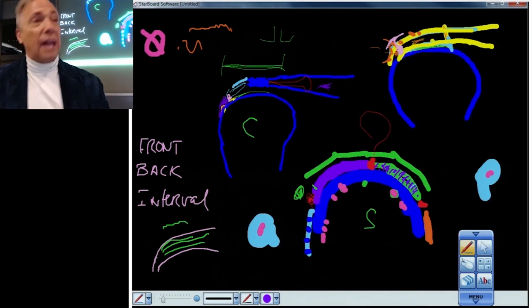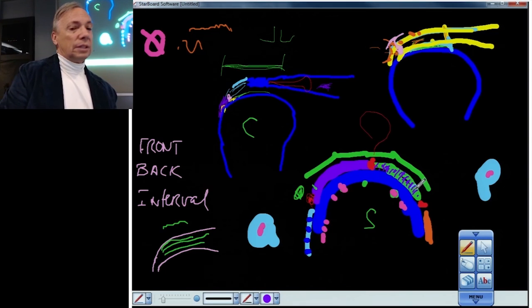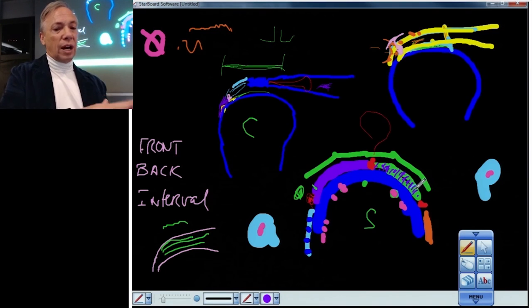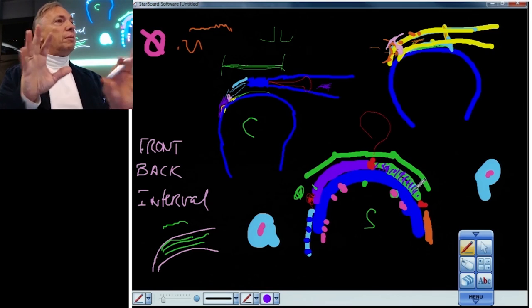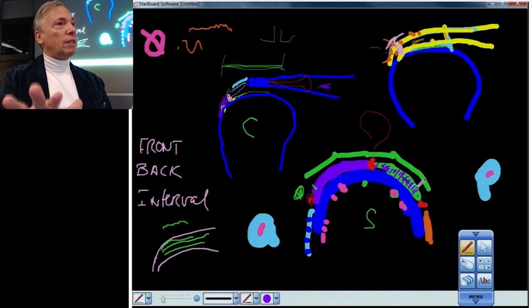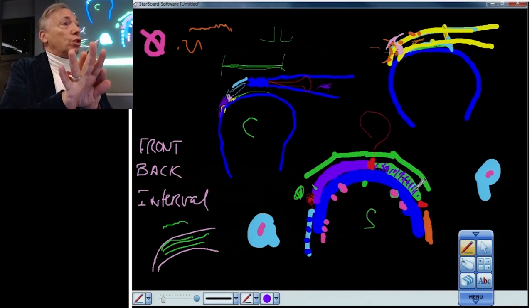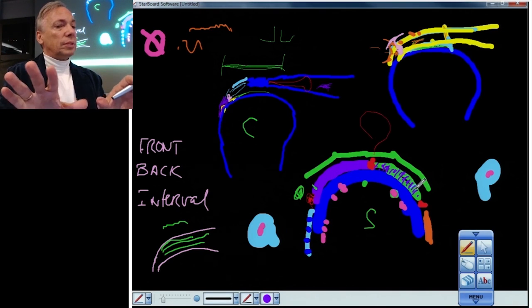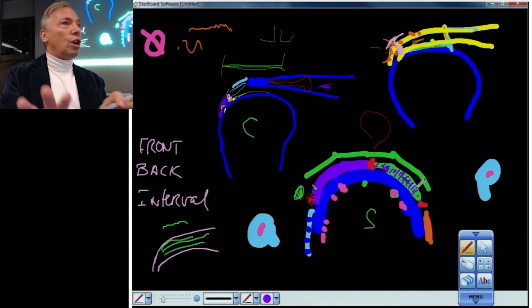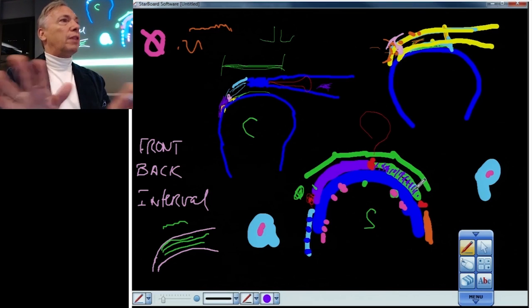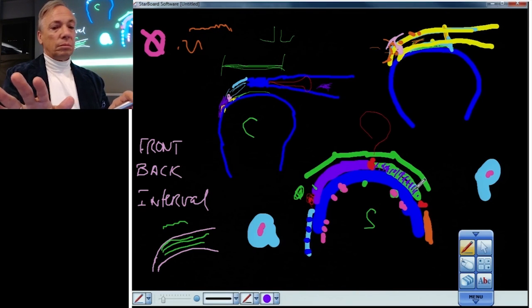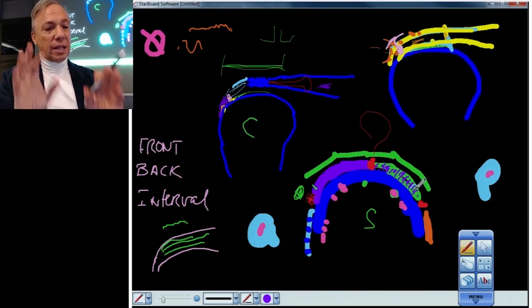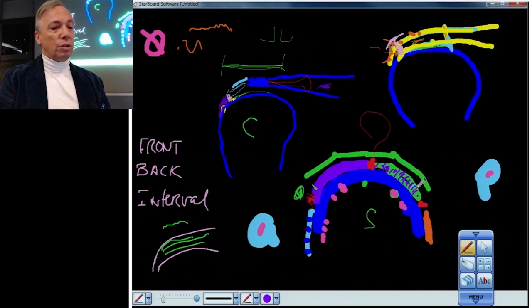It looks a lot like Bart Simpson's hair. They're much flatter in the supraspinatus, it looks more confluent. So if you have inflammation or swelling of the infraspinatus, these hairs, which are tendon fibril subunits, spread apart. A common mistake is to call some of those hairs microtears. That is usually infraspinatus tendinopathy in an internal impinger.